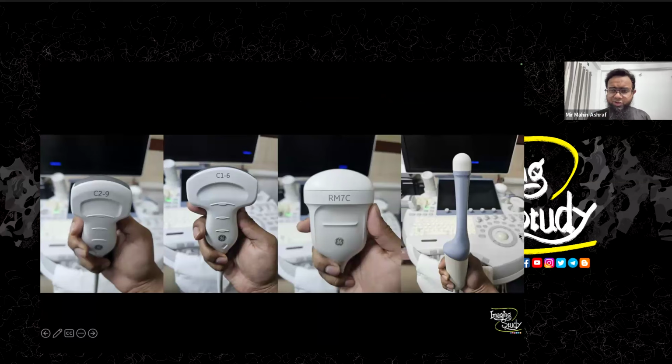I have 4 transducers attached. I think I have another one. 1, 2, 3, 4, 5. Which one is missing? So the linear one is missing. I missed the picture. Okay, anyway, so I have actually 4 curvilinear variety transducers here, which I want to show. So the first one is C29.